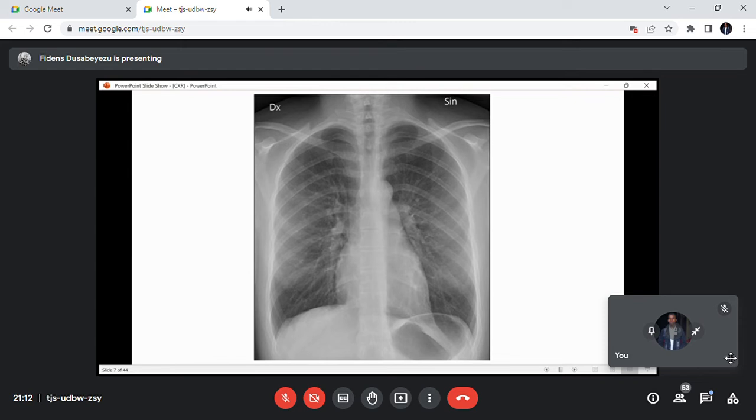We say in radiology that you cannot go from the mediastinum to the lungs without passing through a door or window. But that window, in radiology, you have to look at it before you enter. That window or door from the mediastinum to the lungs is what you call the hila. The hila is not a step, not a list of things you have to look at, but a door, a window.